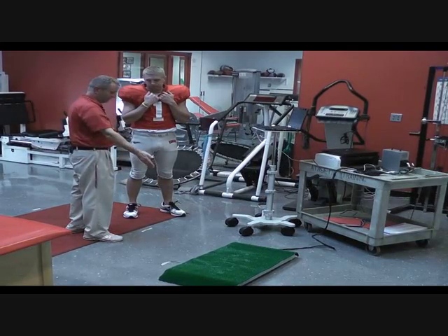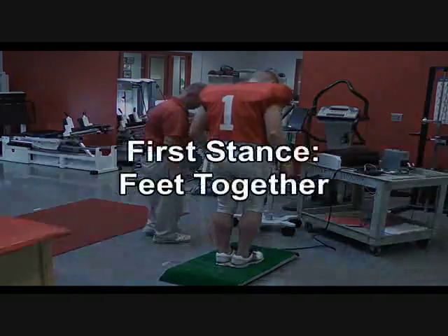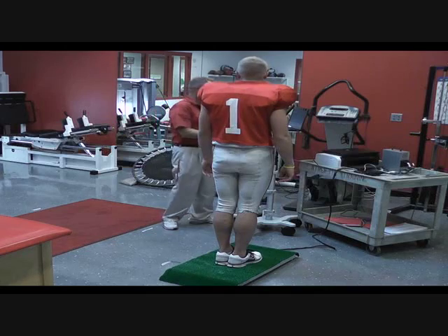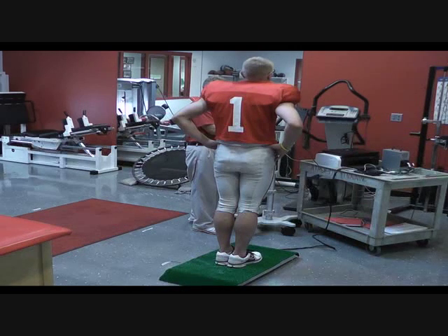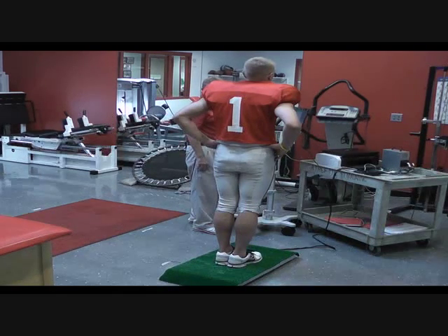So we're going to do your baseline testing here. Start standing on the force plate — face this direction, heels together side by side. We're going to test you for 20 seconds. You're going to have your hands on your hips and eyes closed. Once you close your eyes, we'll start the 20-second count. Ready, begin. The computer is measuring if you have any sway or movement — forward, backwards, right to left — and then it records it. Open your eyes. Good. That was the first test.